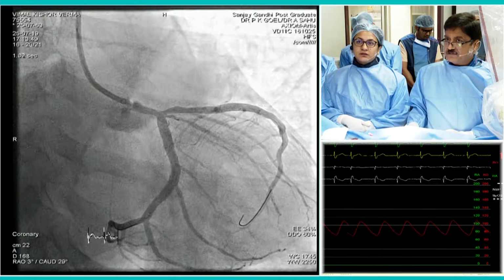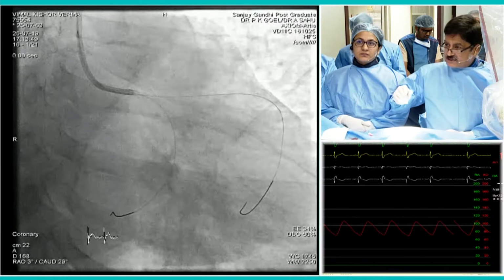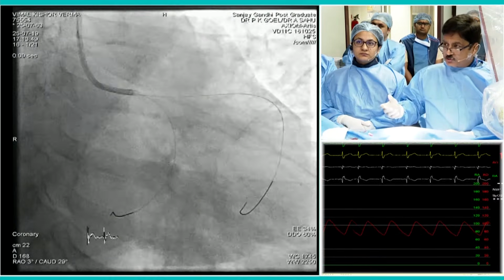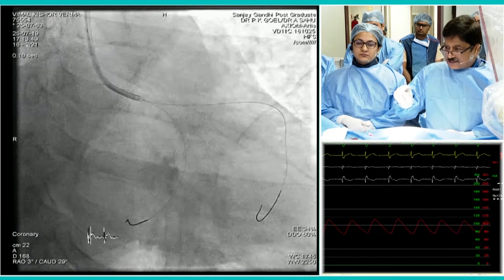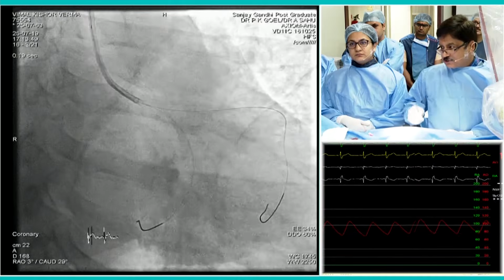The other thing in left main is you have to assess left main angiographically, if you so want to, by thinking what it should be, rather than just trying to compare relativity. So you add the LAD and circumflex and say it should be at least 2/3 of the combination of the two. You know, that's a rough thing.